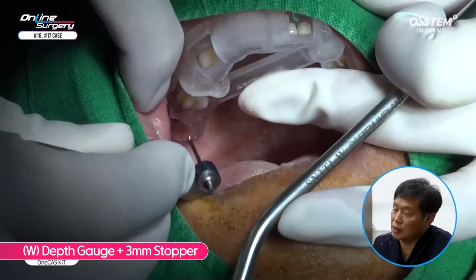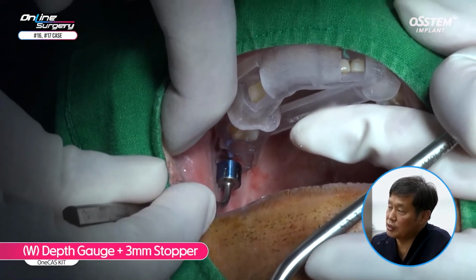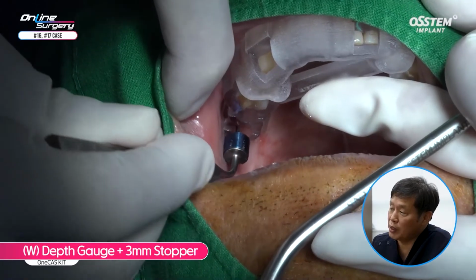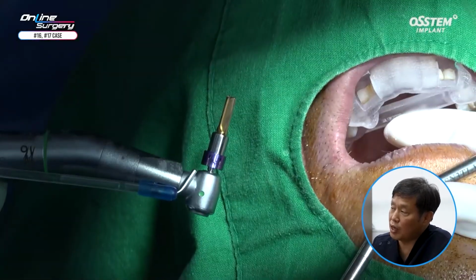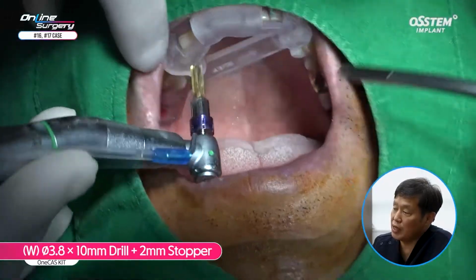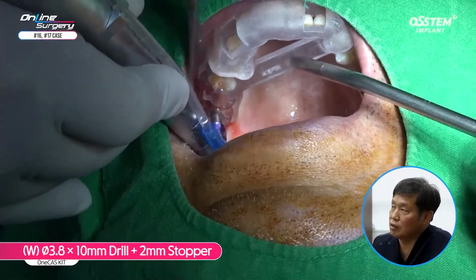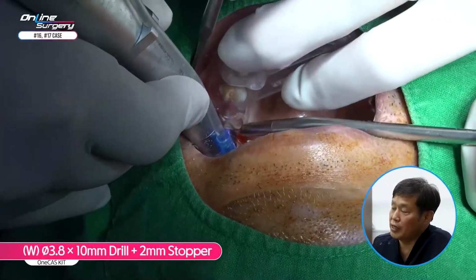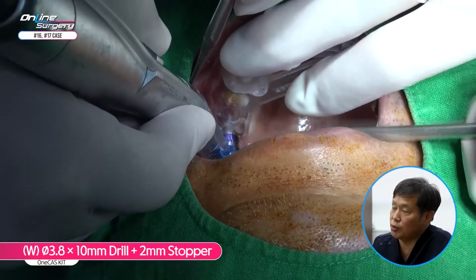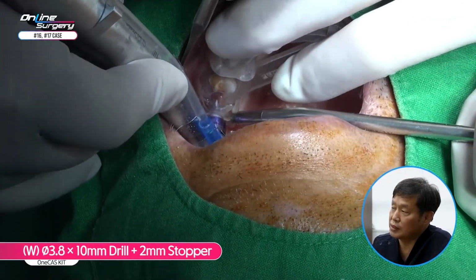With the 7 millimeter drilling done, a 3 millimeter stopper is used to check whether sinus floor penetration is done. You can see that the template is not in contact. A 3.8 by 10 millimeter drill with 2 millimeter stopper is used. This is the final drill and drilling is done up to 8 millimeters.